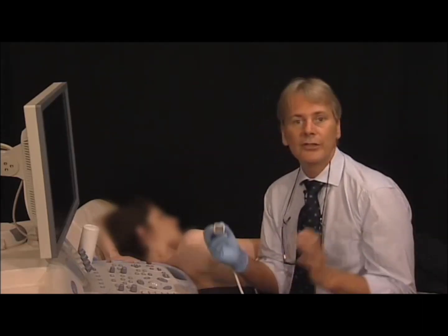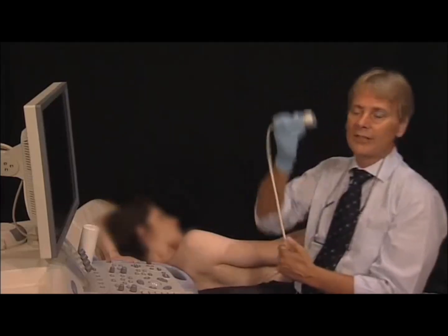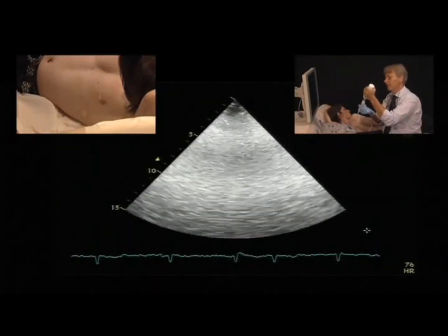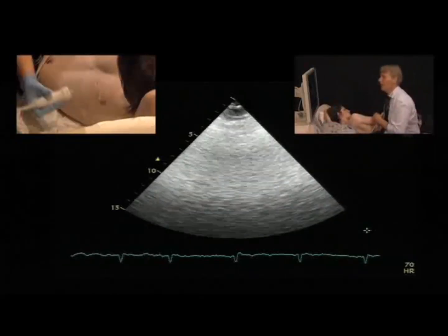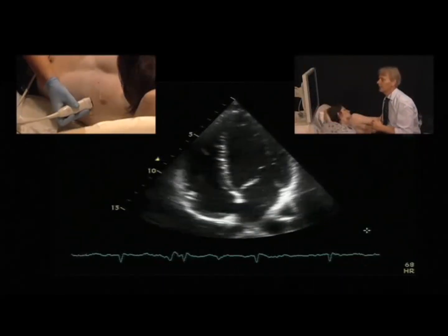The four-chamber view is probably one of the most important views in echocardiography. It's a view where we see very many structures, and it's also a view from which we can find all the other structures more easily. I'll show you how to orient the view and which details you can depict.